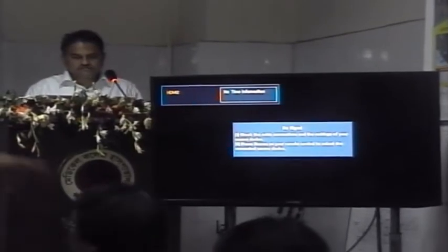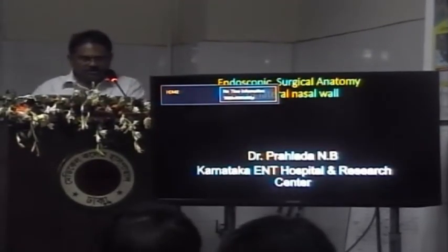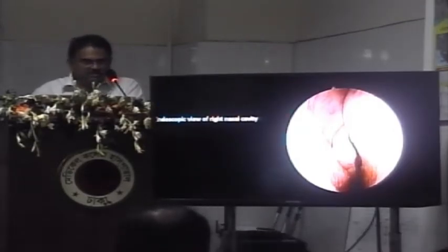I would like to speak about endoscopic anatomy of the lateral wall of the nose. We always start with the endoscopic view of the right nasal cavity. We always do a diagnostic endoscopy systematically, that is first pass, second pass and third pass.